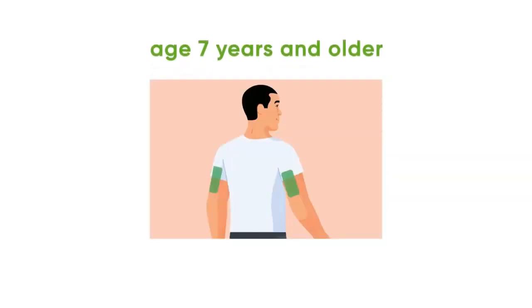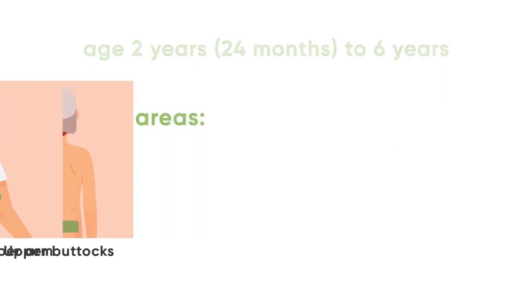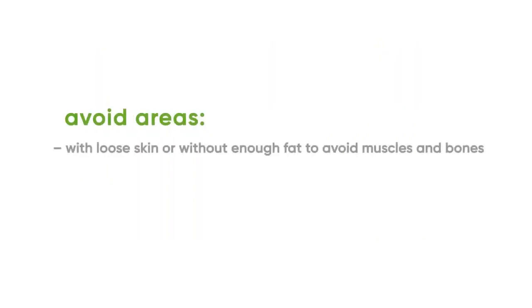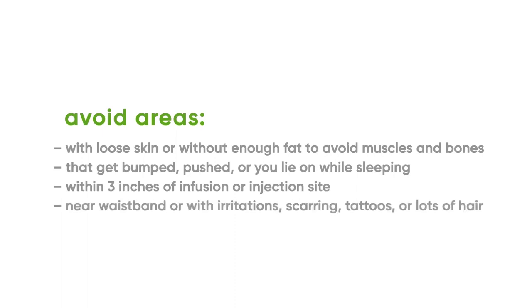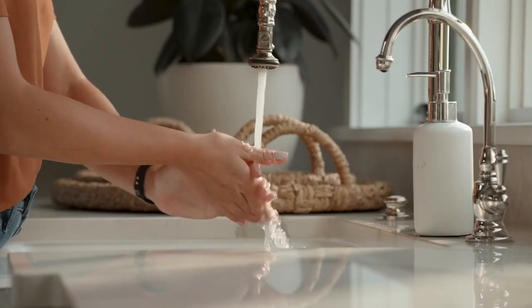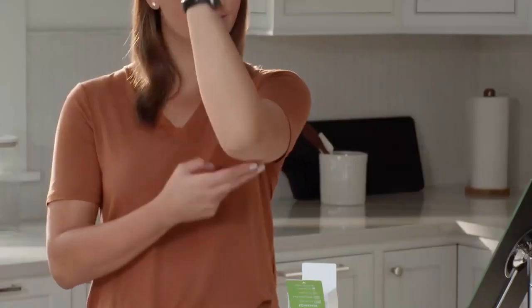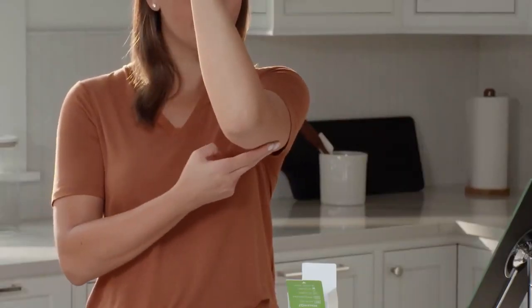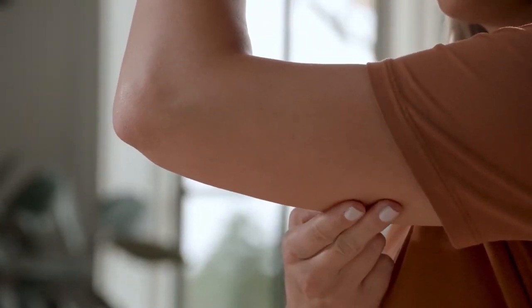To insert your sensor, first choose your sensor site. Before you begin, wash and dry your hands. Choose a site on the back of the upper arm with enough fat to avoid muscle and a site that is not likely to be bumped or pushed.